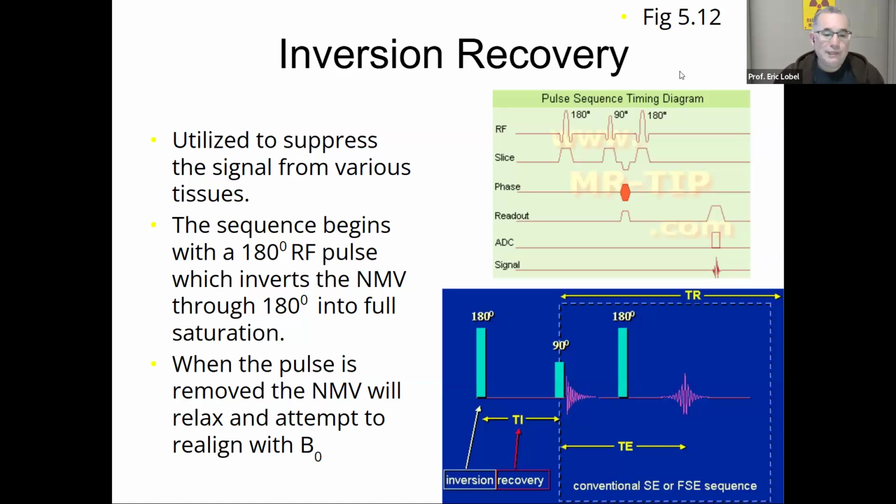But essentially, a high signal intensity, a bright area, if there's something kind of under it or nearby that is less intense, it's going to get swallowed up by the brightness of one tissue, making it harder to see the pathology or the other tissue.